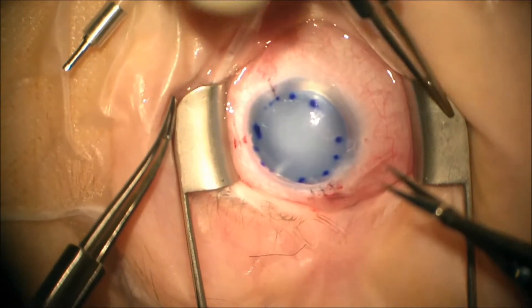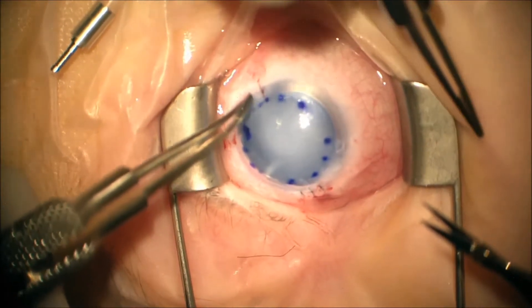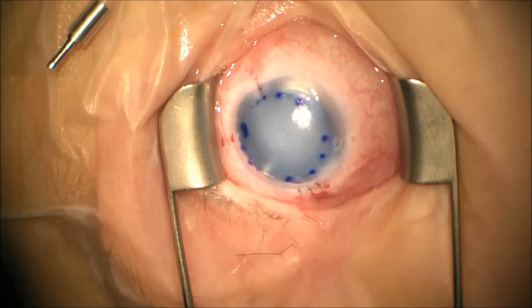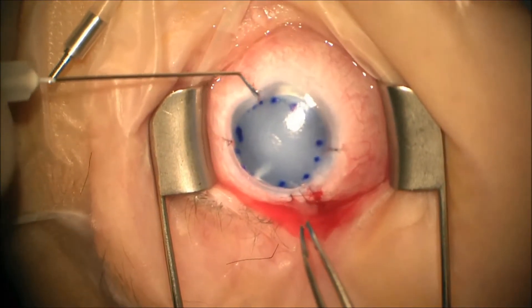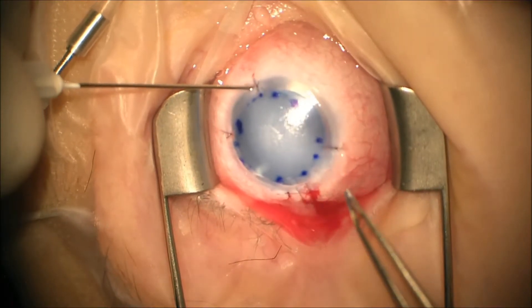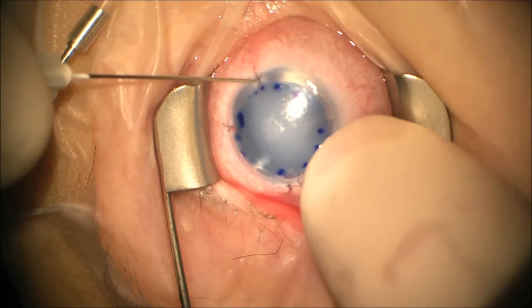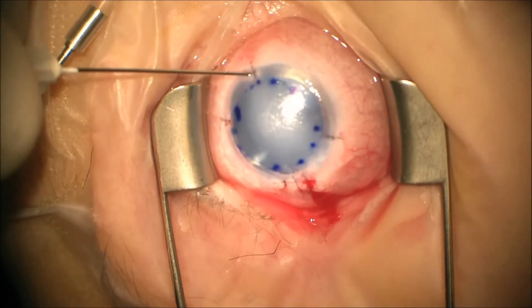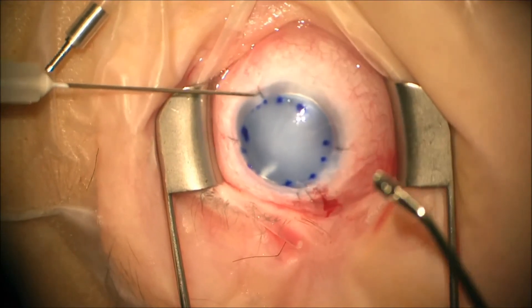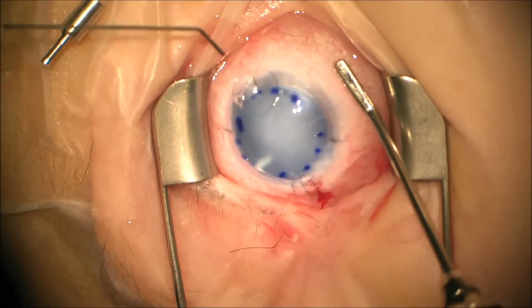This suture will be removed in this patient one week later at a scheduled EUA. We continue to pressurize the eye by injecting a little more SF6 and use the cannula on the BSS bottle to help remove any fluid in the interface.